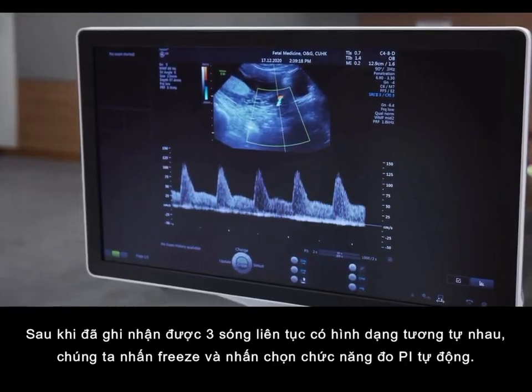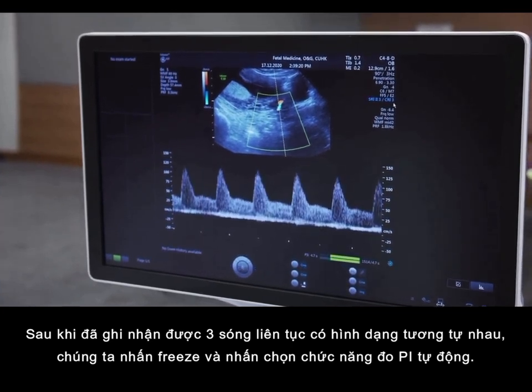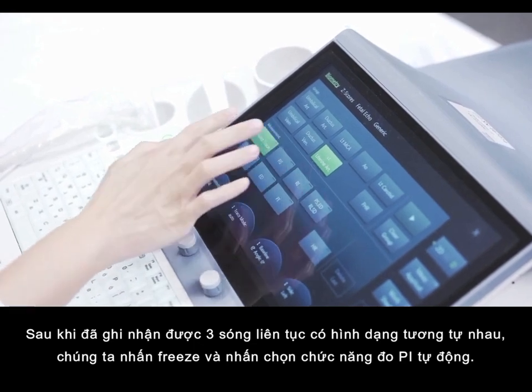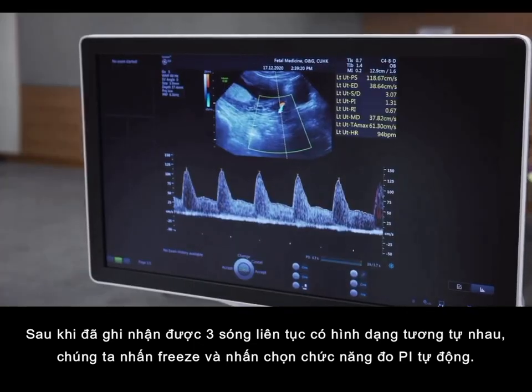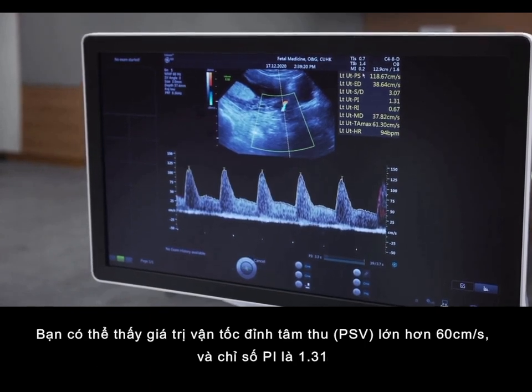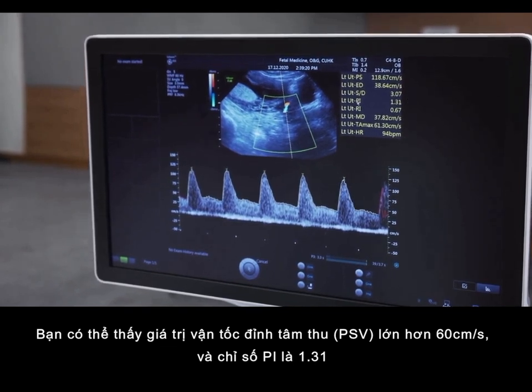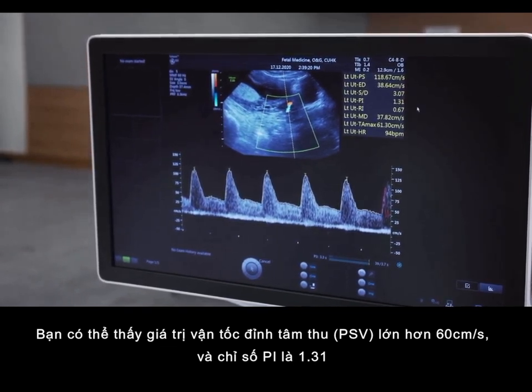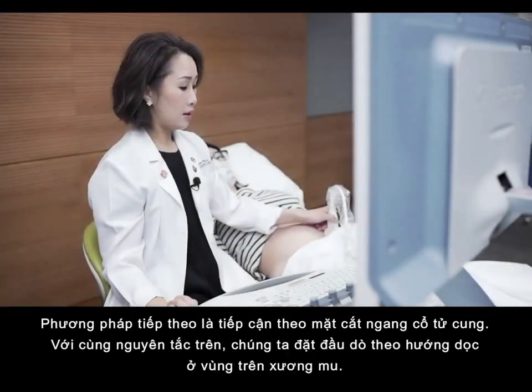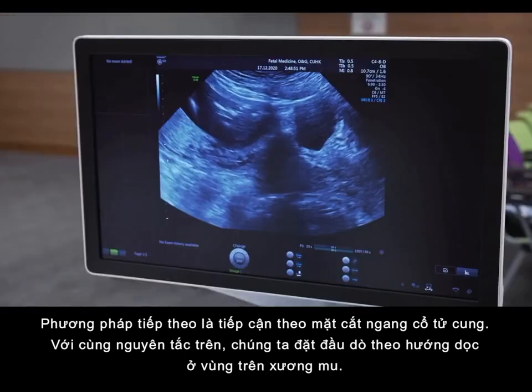Once you have 3 consecutive waveforms that are similar, you freeze the image and use the automatic function to measure the pulsatility index. And you can see that the peak systolic velocity is greater than 60 centimeters per second and the pulsatility index is 1.31.